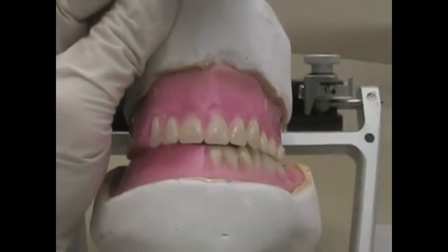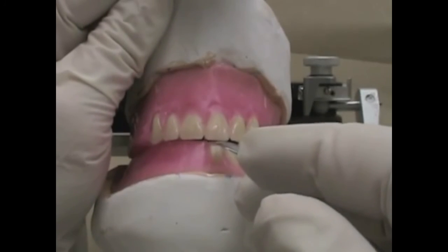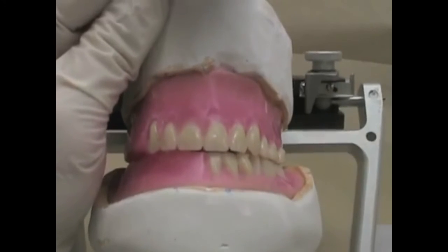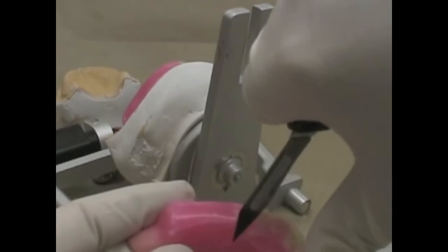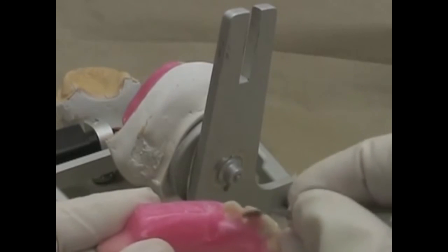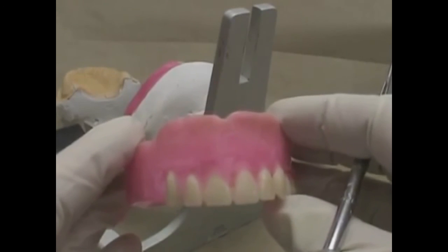When we look from the front here, you can see for the lingualized occlusion, we start off with 0 overbite. It often makes it a little bit easier to get balancing contacts if that's what you desire on a lingualized setup. Again, I'm going to clean up a little bit of the wax around the lingual surface of those teeth, just so I don't have so much bulk. When I go to set the posterior teeth, I may have to move the anterior teeth just a little bit. I want to keep things neat and tidy so there's very little work left to do when I'm finished.